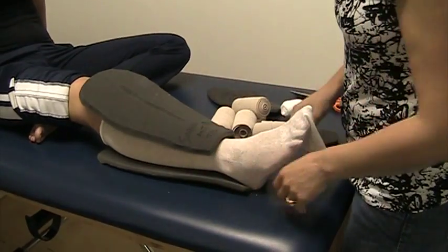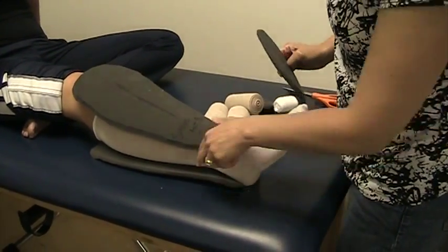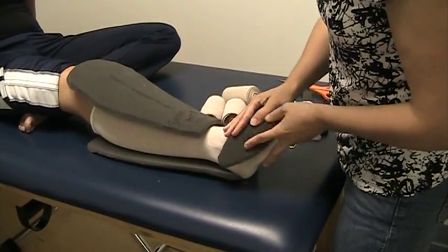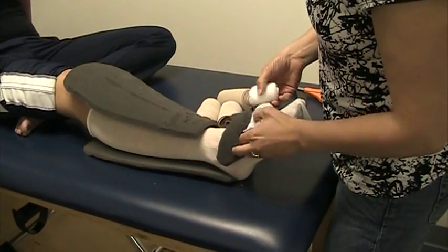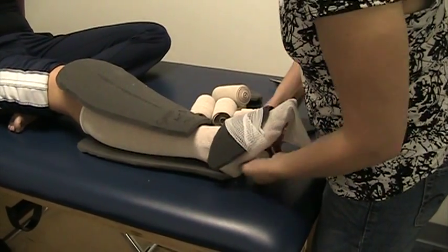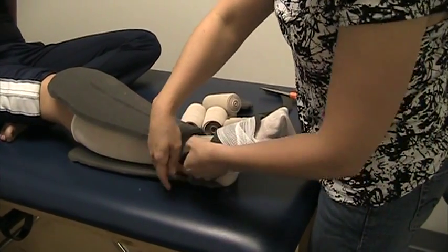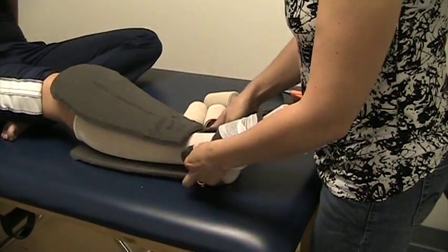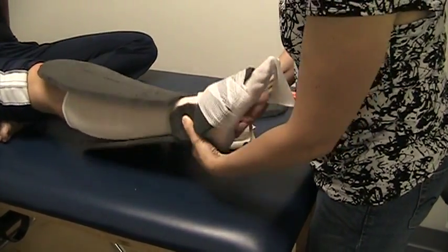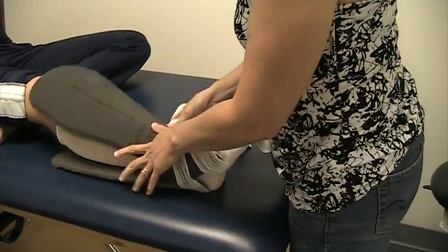This is the application of the short stretch multi-layer compression bandages, utilizing stockinette over the patient's leg, followed by the application of the gray foam. The gray foam is applied to the leg using a two-inch gauze wrap to keep it in place. We have a dorsal pad, and ankle wheels placed on both the medial and the lateral malleoli. We have a posterior piece of gray foam — it's half-inch in thickness.